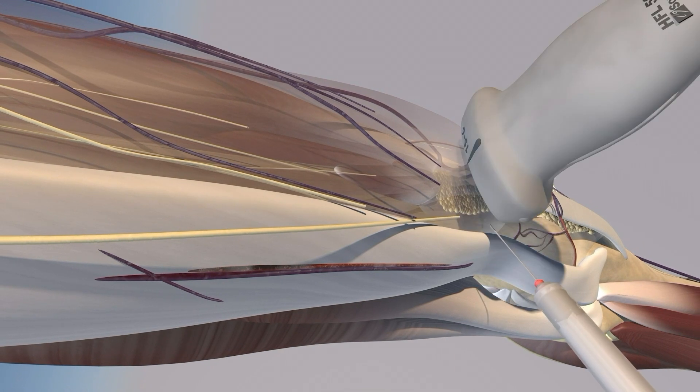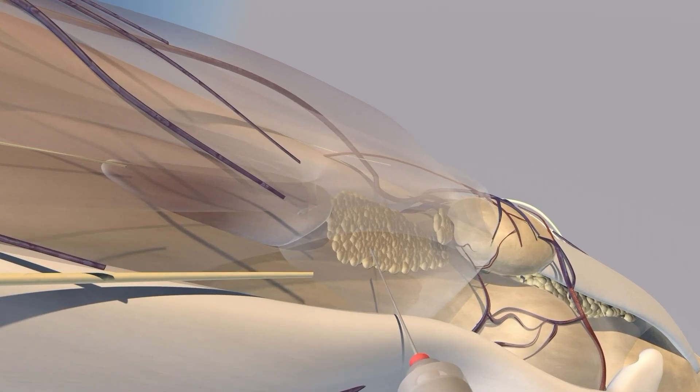Here you can appreciate some of the fat pads — you're trying to get your needle anterior to the pre-femoral fat pad. We're now performing our injection, and you can notice how the needle is going anterior to the pre-femoral fat pad.